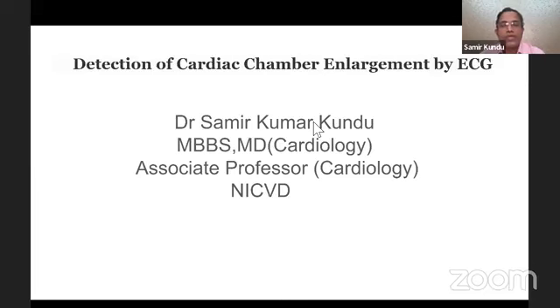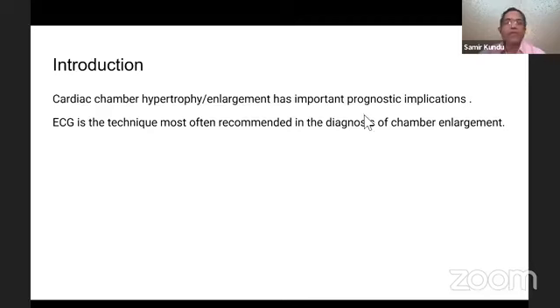Welcome to you all. Today's ECG lecture number 61, topic: cardiac chamber enlargement. Detection of cardiac chamber enlargement. Introduction.